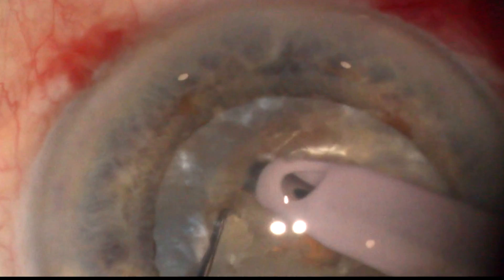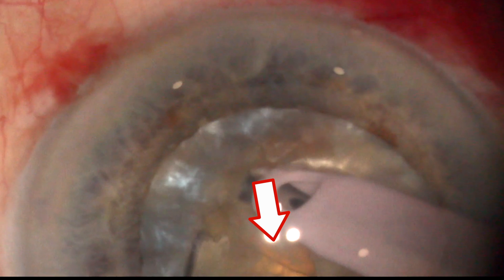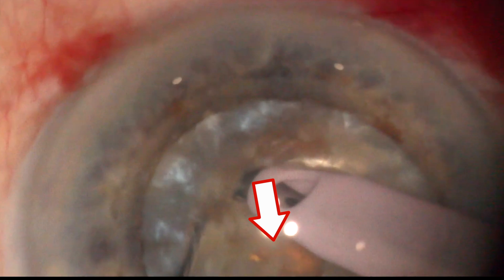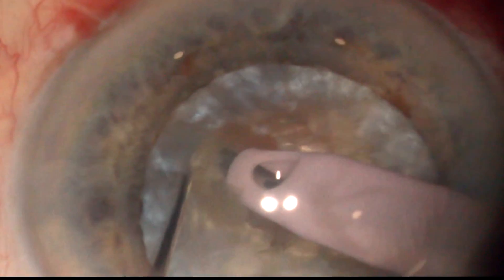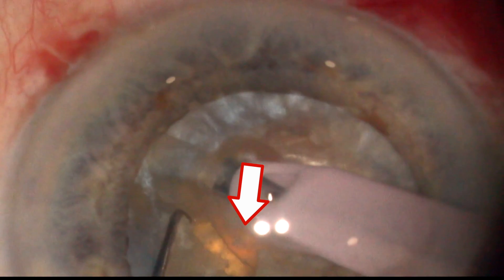Twenty or more microchops are performed, and with each microchop we can observe an endonucleus dissection plane. Checking appropriate endonucleus dissection is important for complete endonucleus isolation.